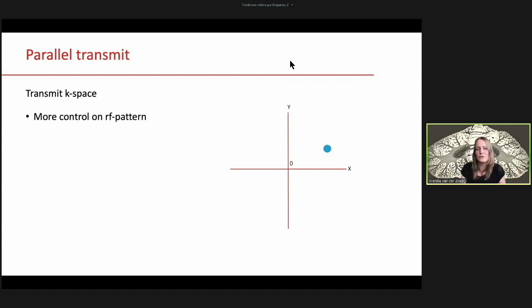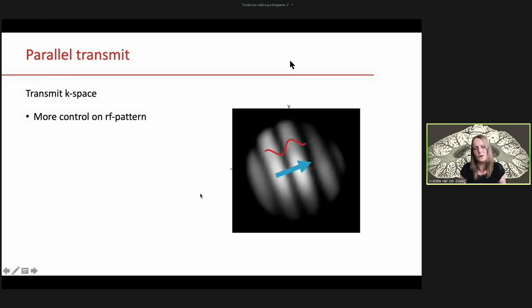So if you think of a transmit K-space as a way of imposing the same control, but on the spatial pattern of the excited slice or slab, then moving your excited point in K-space away from the center means exactly that. So now we don't have a homogeneously excited phantom. There's a ball phantom behind here, but we have superimposed on the shape of the ball a sinusoidal pattern.